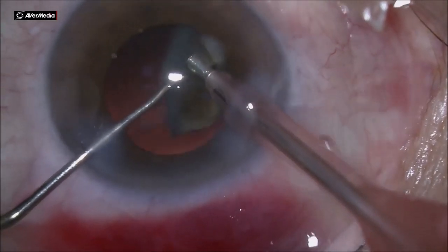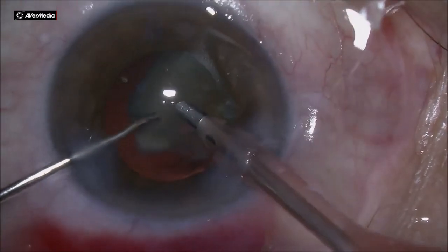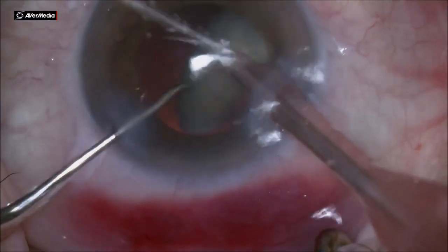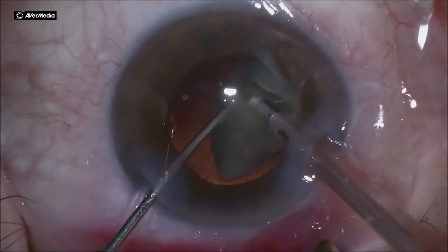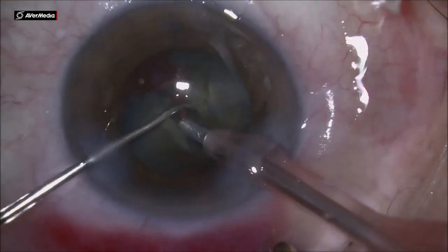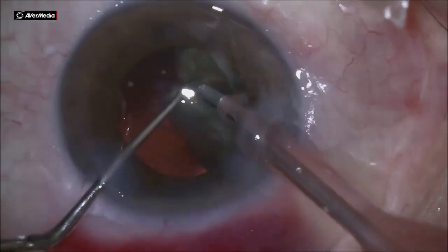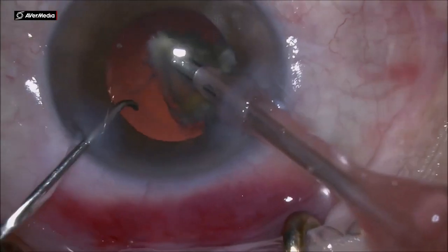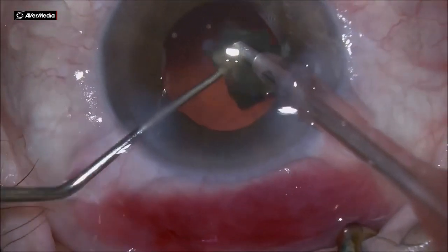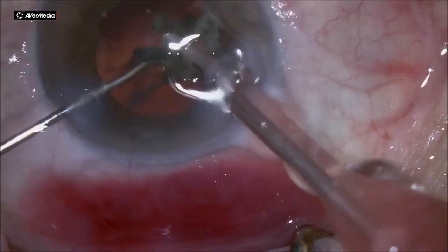At the end of phaco emulsification, for the last piece, we should add some more viscoelastic underneath the last quadrant — not only on top but underneath as well — to protect the posterior capsule. Using the chopper, we can not only crack the nucleus into smaller and smaller pieces with more chops, but we can also use it to keep the fragment at a lower level compared to the phaco tip and hold the posterior capsule in place.